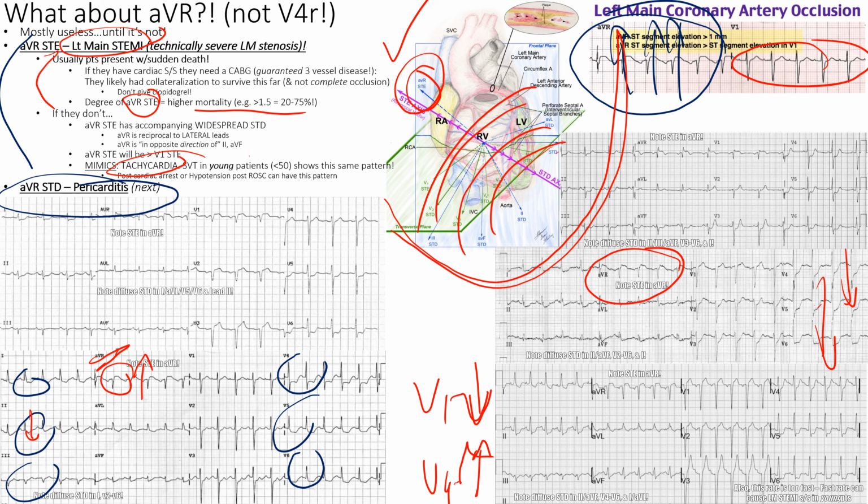But I see it's profound ST depression over here, right? A little bit of ST depression over here, right? A little bit there, but definitely some AVR ST elevation. That is considered a huge MI, right? That we want to escalate.